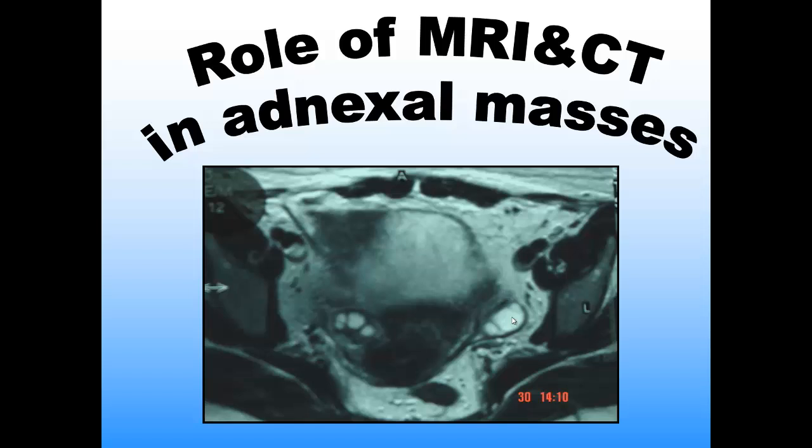Of course, there is a wide spectrum of the appearance on MRI regarding the size, according to the age, according to the parity, but that will not be in this lecture. But we have another lecture on the channel on the normal anatomy of the ovary on MRI.